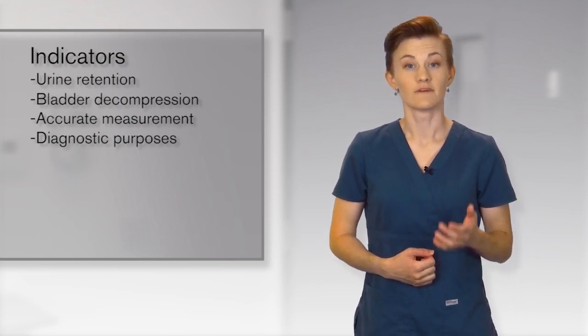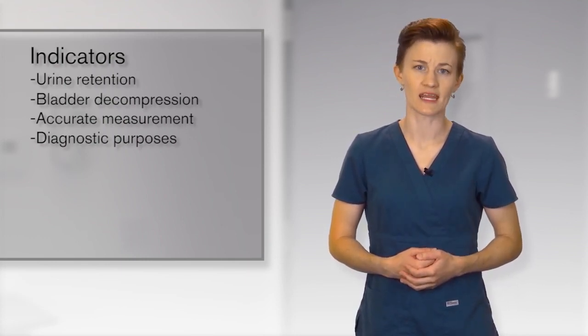Inserting a catheter for urinary elimination can be a traumatic event for the patient. The nurse needs to provide information and support at the level of the patient's understanding. Our nurse, Christy, will demonstrate this throughout the procedure. It is also important to note that an indwelling catheter is the most common predisposing factor for a hospital-acquired urinary tract infection, so careful aseptic technique is required. Pay attention to how Christy maintains sterility during that part of the procedure.